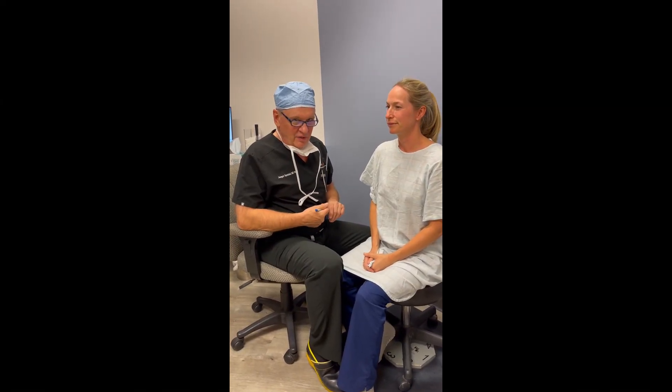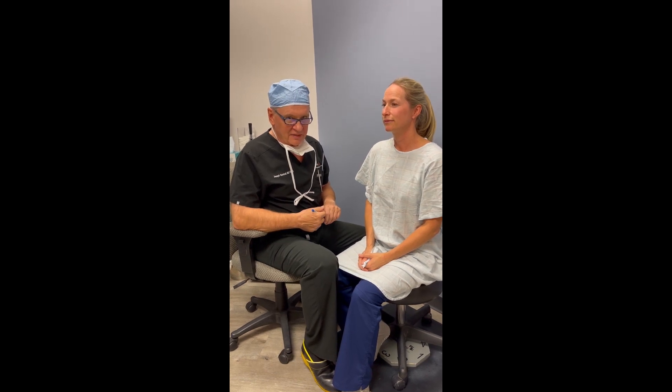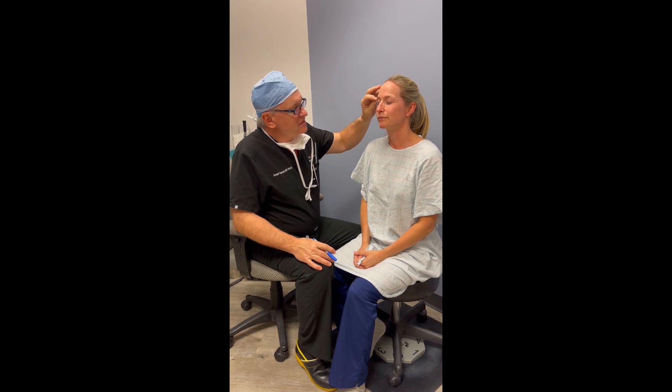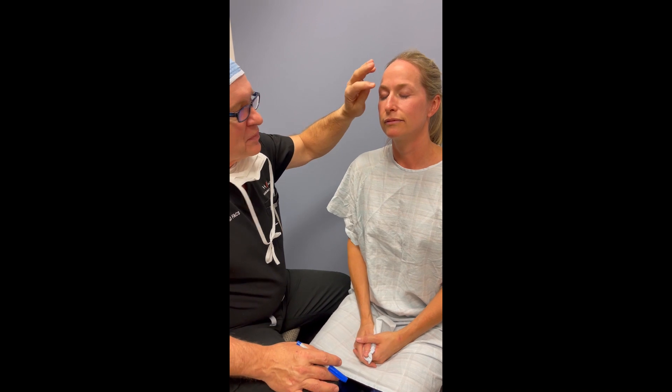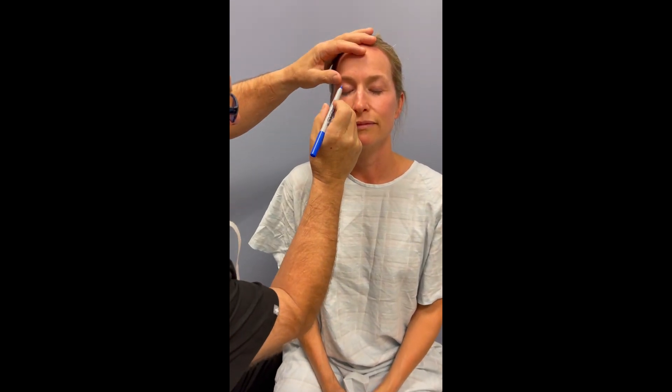Today we're going to be performing the markings for an upper lid blepharoplasty. We have a patient here who has redundant skin, excess muscle, and some fullness that represents some fat.